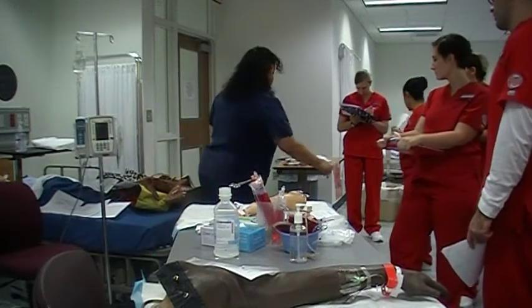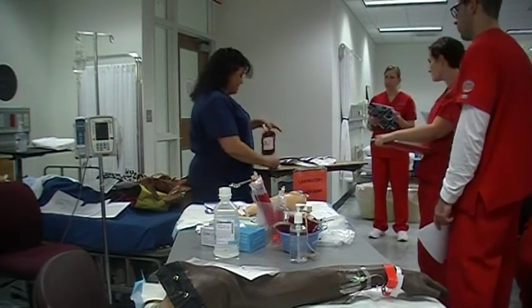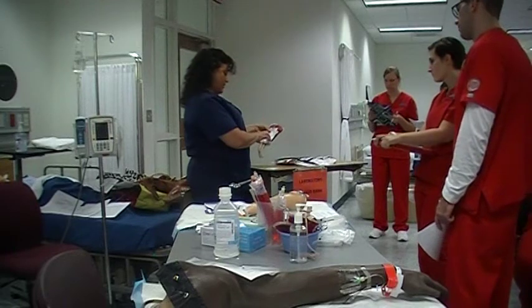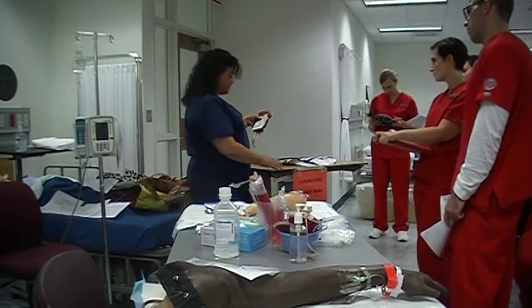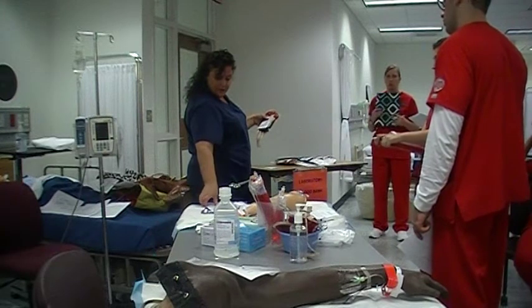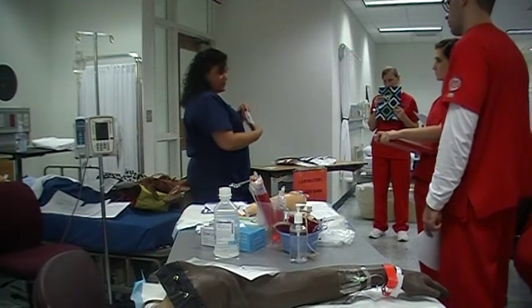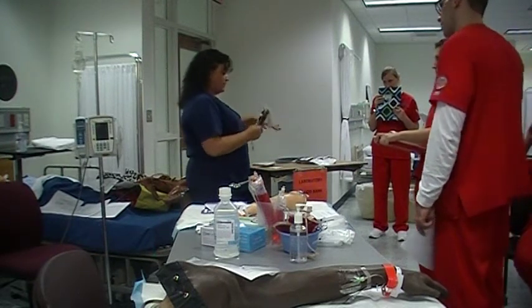When you go over to the blood bank, you're going to have 4 units of blood, okay, and you have to pick the correct one, obviously. So what you do is you look at the tag and start with the name, Robert Davis, hospital number, medical record F00712-367, bring your glasses, and Robert Davis, 712-367, date of birth 3/25/1948, so it has all that proper on there. Blood type A negative, that's the patient's blood type, and then this unit is A negative. I just happened to pick up the correct one. But you don't have to look through all of them if you're sure you have the right one, just the way they're on the table.